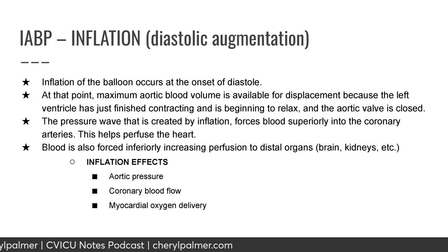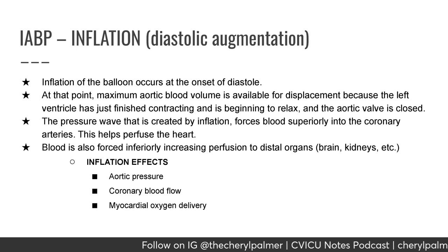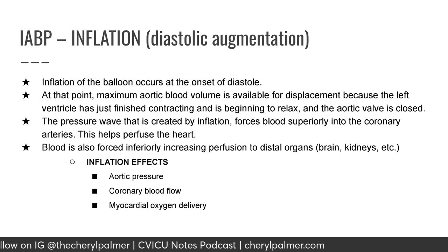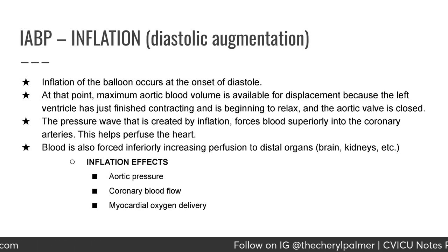For the balloon pump inflation, which is diastolic augmentation, inflation of the balloon occurs at the onset of diastole. At that point, maximum aortic blood volume is available for displacement because the left ventricle has just finished contracting and is beginning to relax, and the aortic valve is closed.